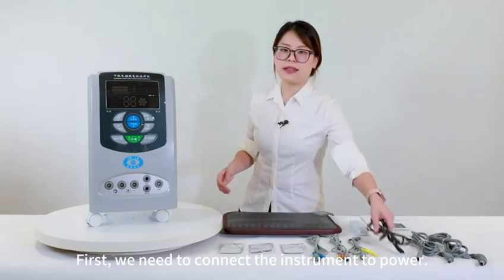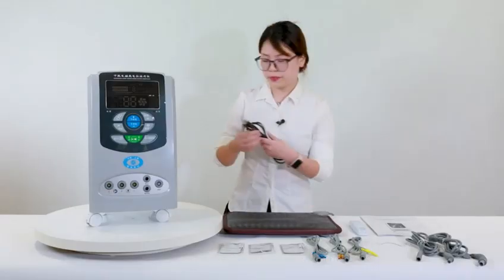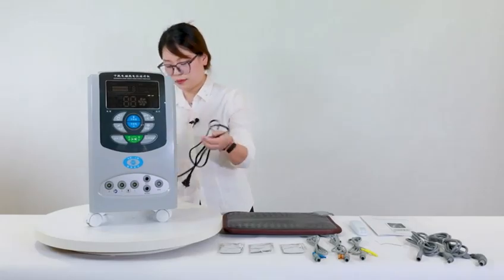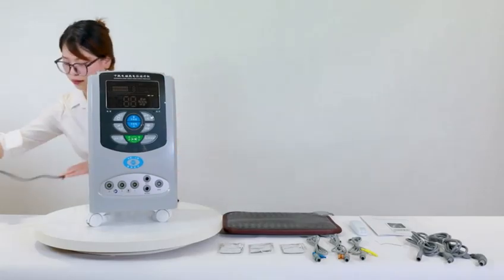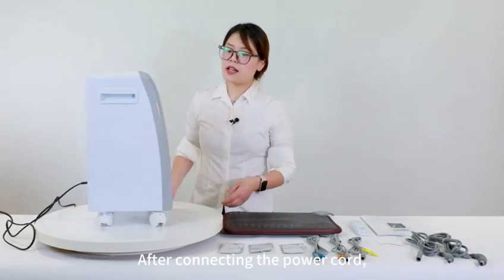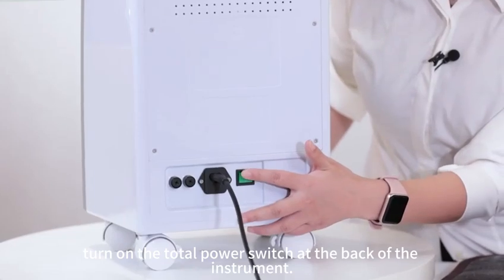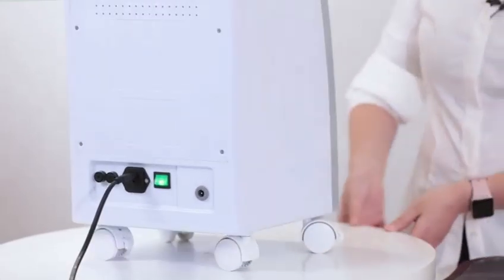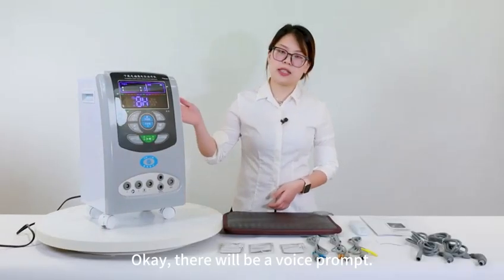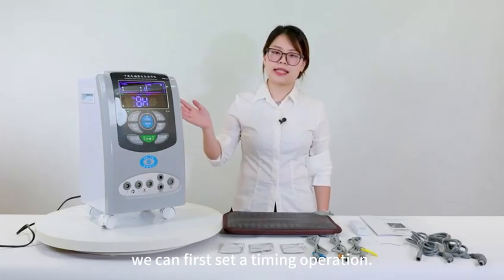First, we need to connect the instrument to power. Take out the power cord and turn it on. After connecting the power cord, turn on the total power switch at the back of the instrument. Okay, there will be a voice prompt. After the voice prompt, we can first set a timing operation.